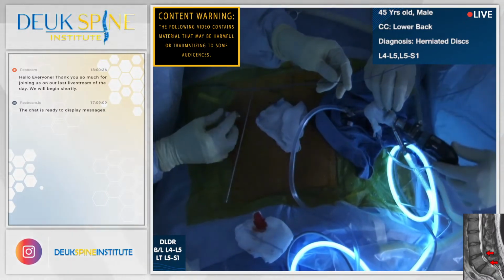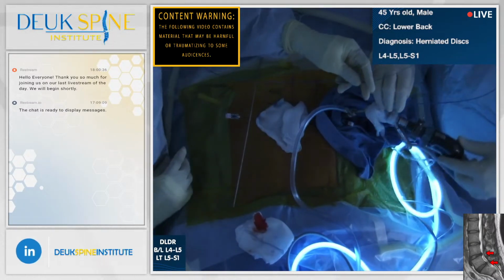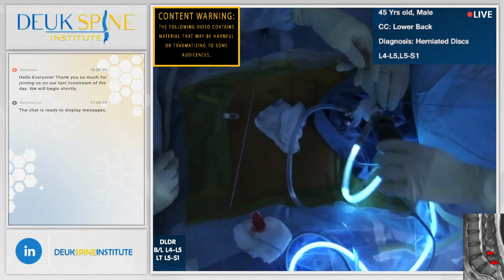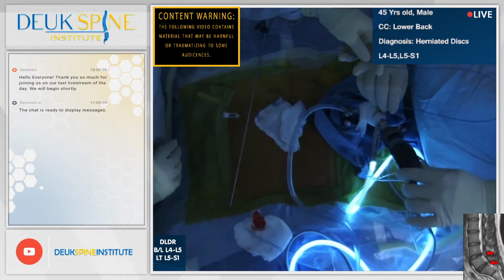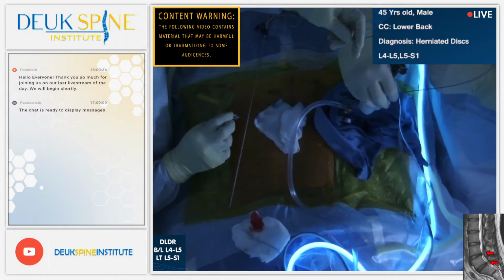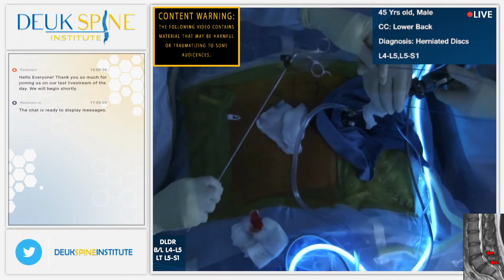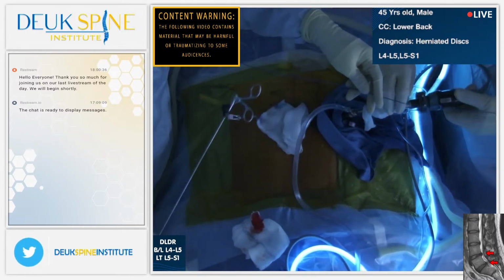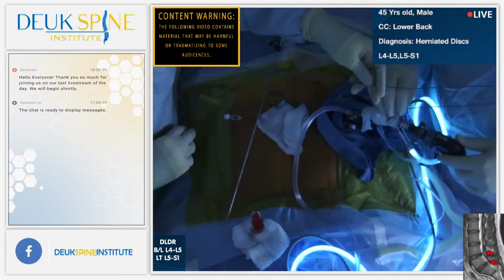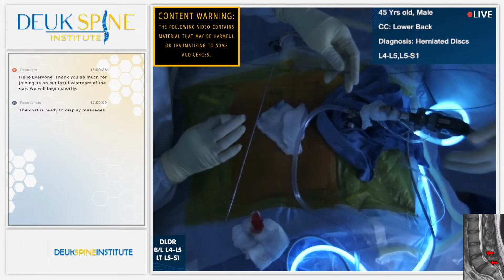I really don't want to hit it too much because it'll literally melt the steel, which I think I've already done. Look at how it's melted the steel. Are we okay? Is it moving? Yeah, I actually moved. Look at the tear right here next to the needle. See the tear that I'm in right now? Look at how can you separate the two? All right. Yeah, look at that, guys.